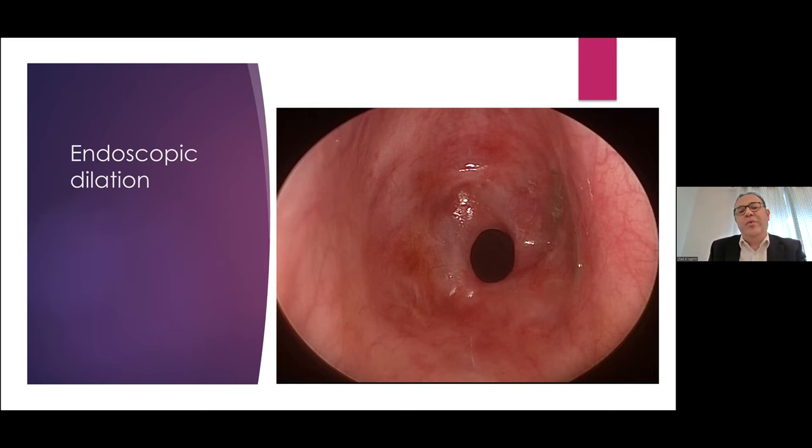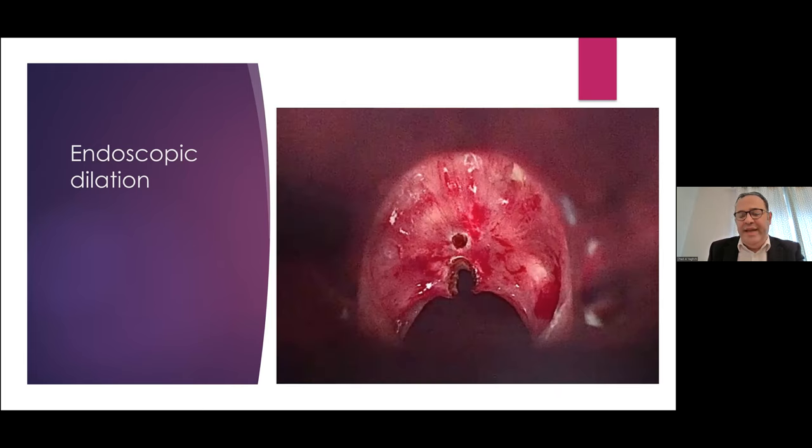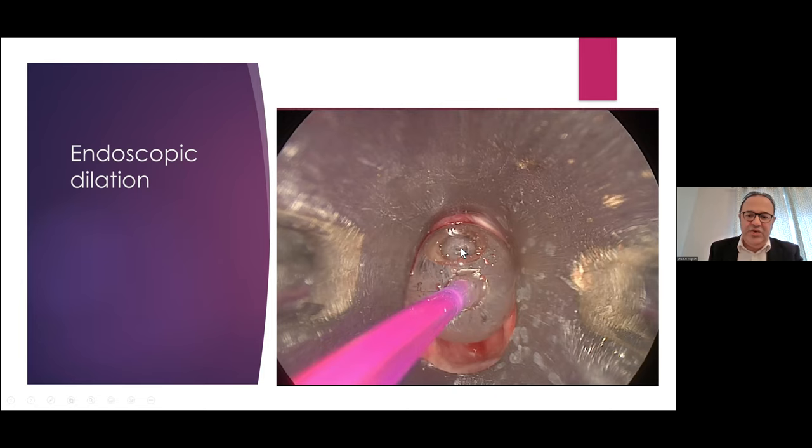So I thought I'll just show you quickly how we do our endoscopic dilation. This is for idiopathic or vasculitis, post-intubation subglottic stenosis. You can see we do these cases with high-frequency supraglottic jet ventilation, no tube in the airway. We start first by injecting longer-acting steroids, so we use triamcinolone or methylprednisolone. We make laser cuts. I like to do a Mercedes star, so I do three laser cuts. I go through all the scar tissue before I do my balloon dilation. That is like a releasing incision and prevents tearing the mucosa and the tracheal wall. And we dilate up to 16.5 millimeters.